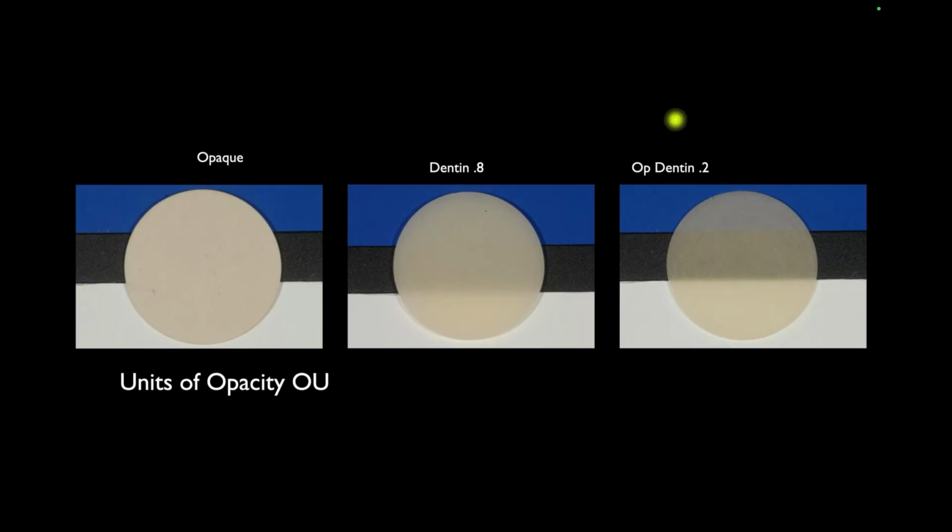You tend to work with them at 2/3 of a millimeter, which means they're much thinner, which means they're much more translucent. So yes, putting opacious dentin somewhere at 2/3 of a millimeter doesn't really help you, I guess is the point I'm trying to make, unless you can really increase chroma, increase fluorescence, or increase thickness, which normally you won't have the ability to do.